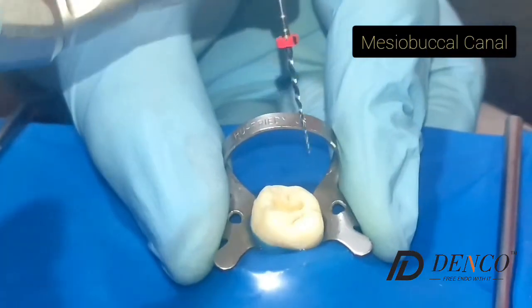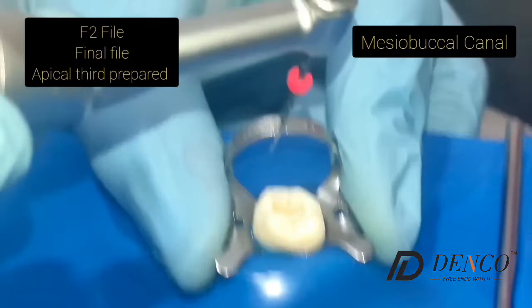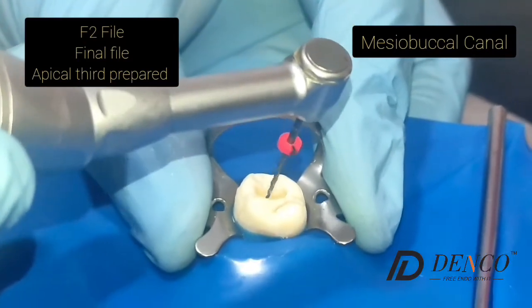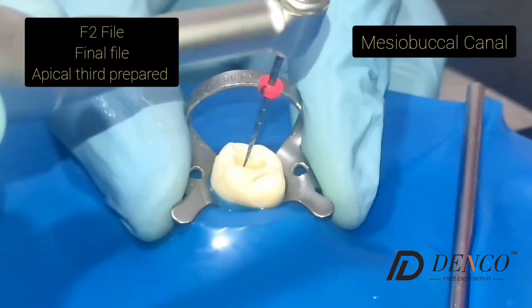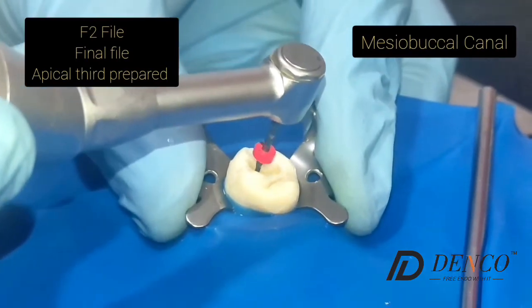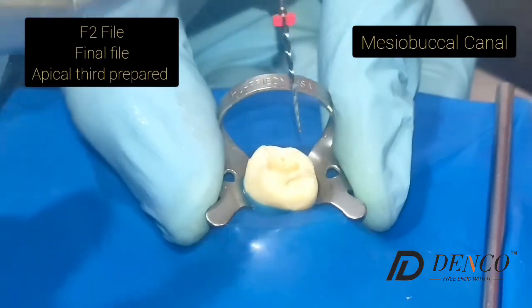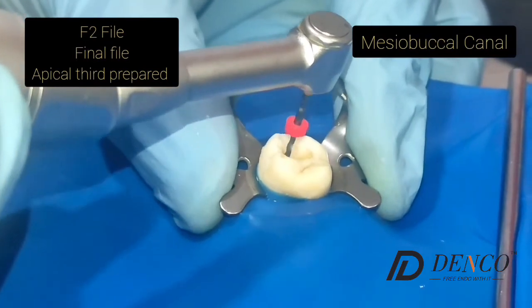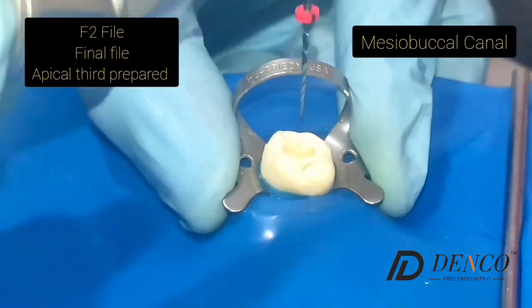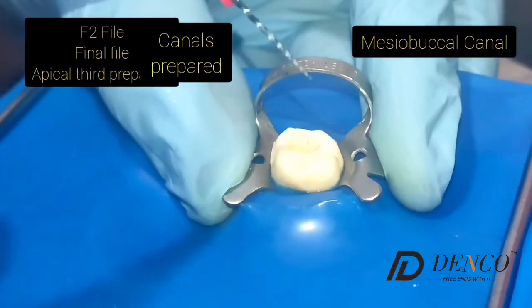We are going to finish the apical preparation of the canal with an F2 file, using it like the F1 — reaching the apical third with light apical pressure. This is the finishing file in this canal. One, two, and three movements, and there we are. We have finished our preparation of the canal.